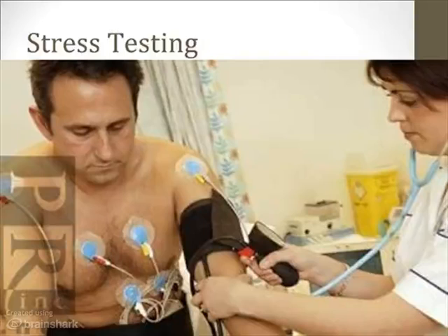The patient's ECG and blood pressure are monitored during the test. The risk of doing the test is possibly suffering a myocardial infarction and death. It can actually detect irregular rhythms, peripheral artery disease, exercise-induced hypertension, as well as evaluate the effectiveness of medications and regimens.